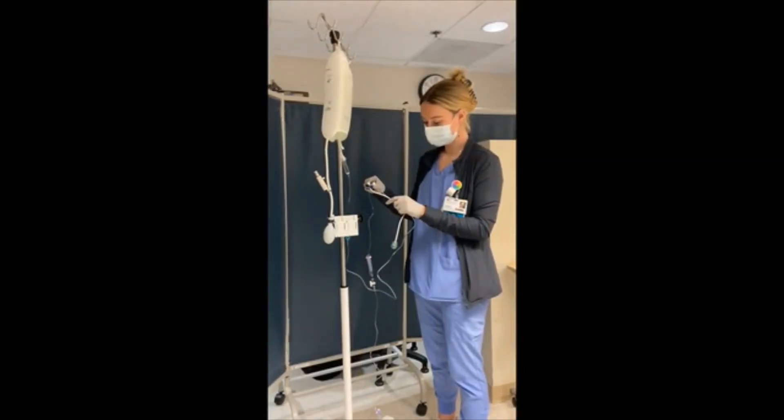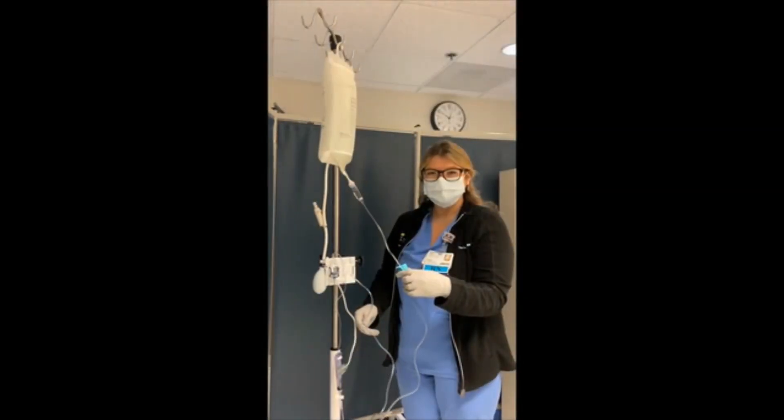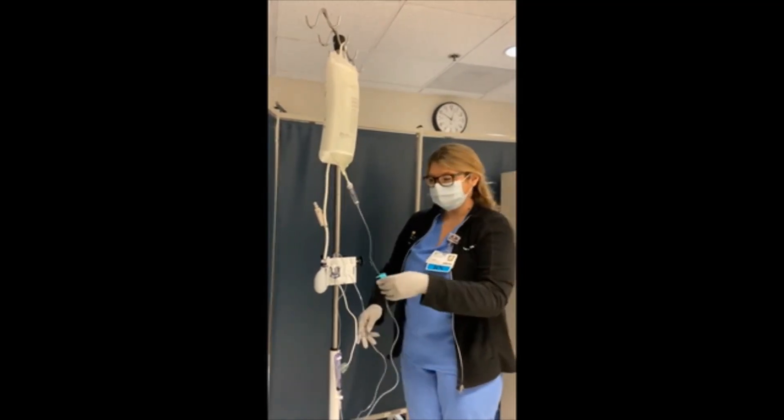Place the transducer holder on the IV pole with the pigtail facing down. Unclamp the first half of the IV tubing. Remove the white vented cap from the transducer.